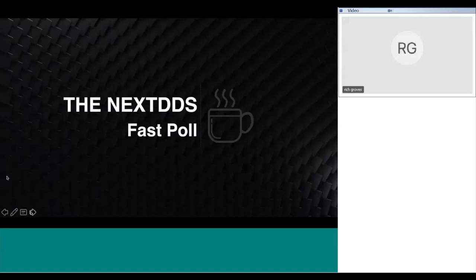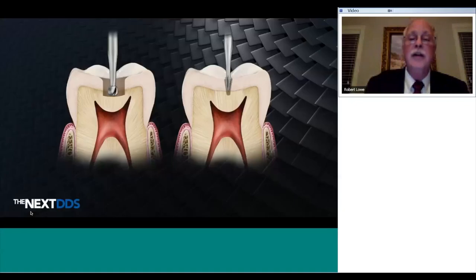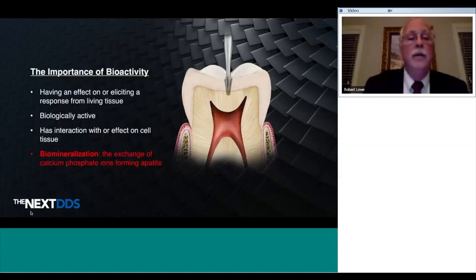All right. Let me see if I can find my button again here. We're going to continue with that fissurotomy and then move into fixed, because I think it's important to differentiate. On the right, you see a fissurotomy burr that's designed for minimal tooth removal to gain access to early detected carious lesions, versus a typical 330 or other type of burr that's commonly used to cut a more extensive preparation that not only takes out the decay but removes a lot of healthy tooth as well.